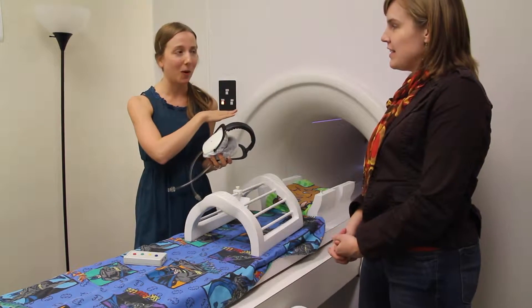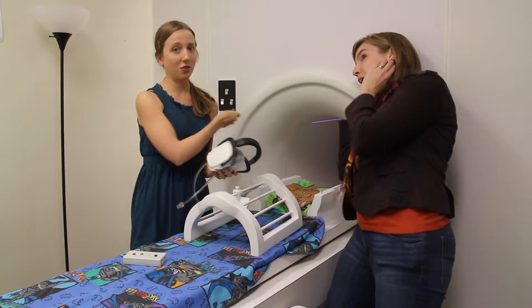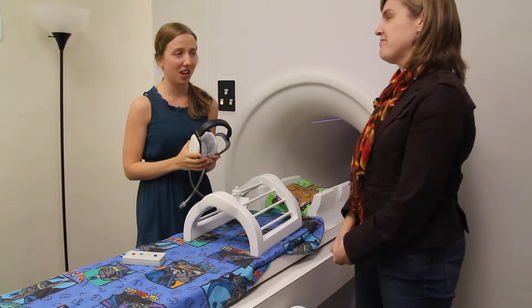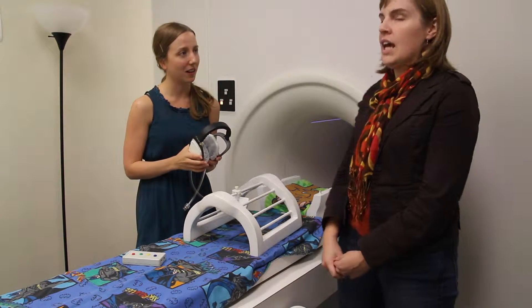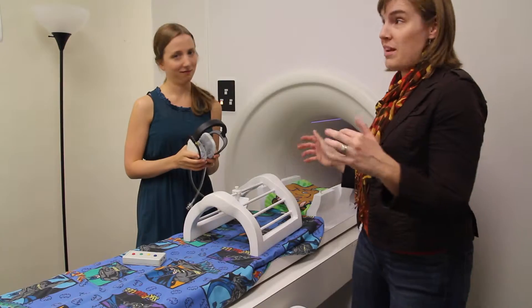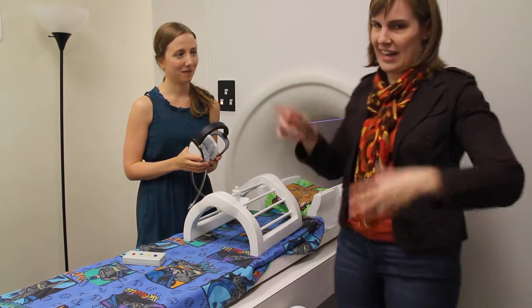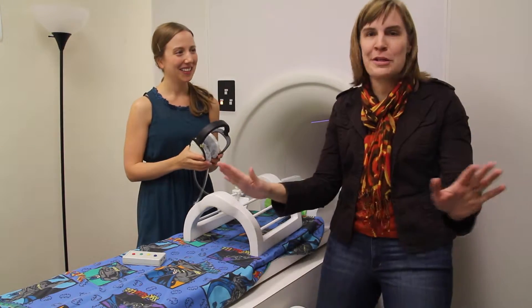We don't want to put anything by the MRI scanner that is magnetic, because it is a giant magnet and it will get sucked in. For example, if this was a real MRI scanner — do you see Sarah's pretty earrings? Those would be pulling right in towards there. They could even tear out of her earlobes. We don't let anyone in there who has metal inside their body who might be magnetic. All those medical shows where they put people in MRIs with pens sticking out — that's not safe and not how it really works.